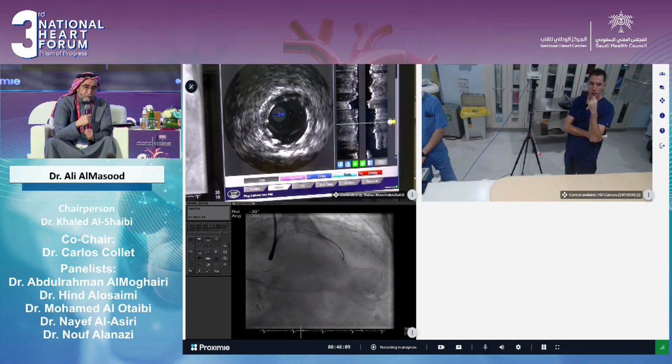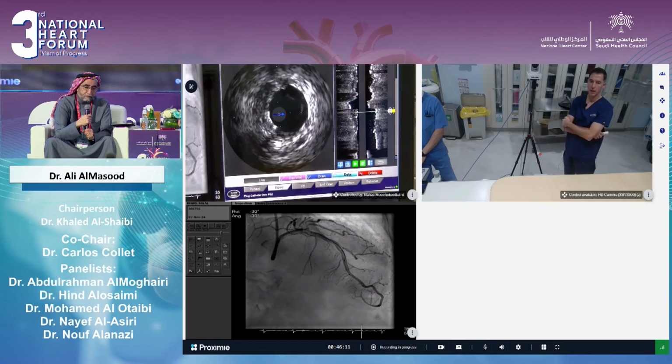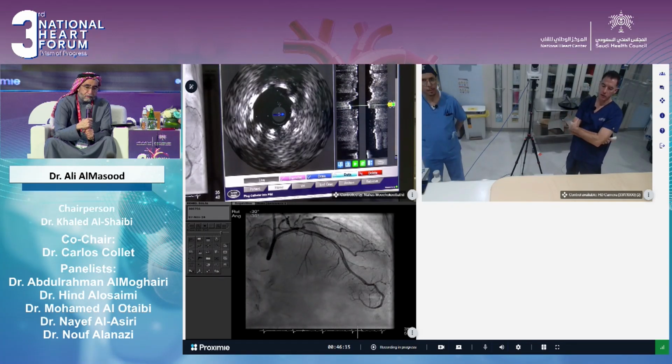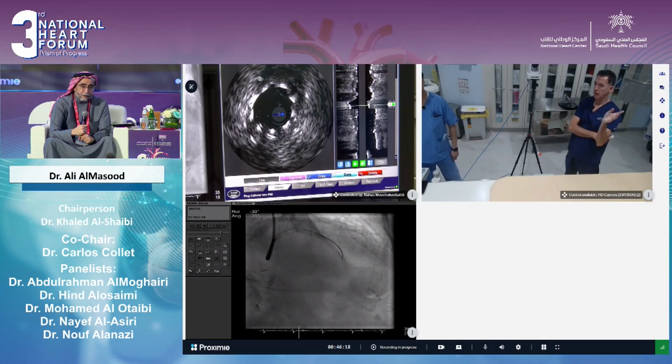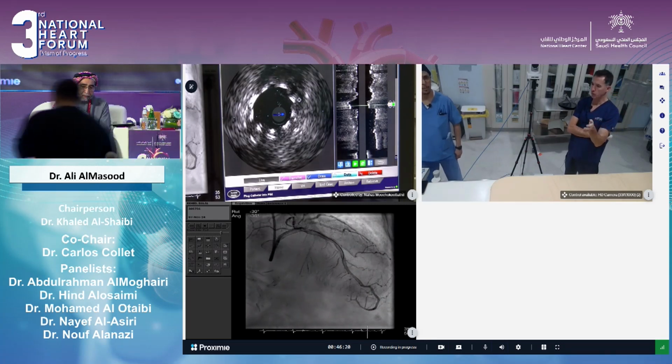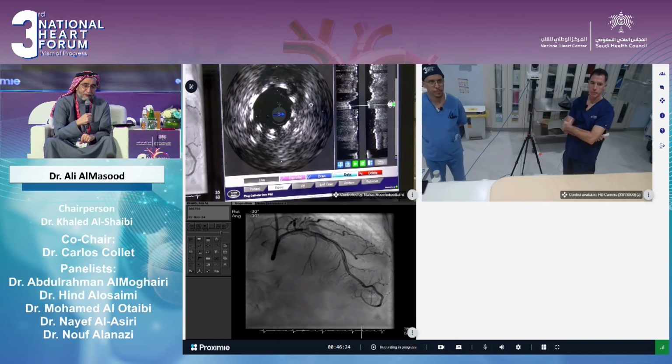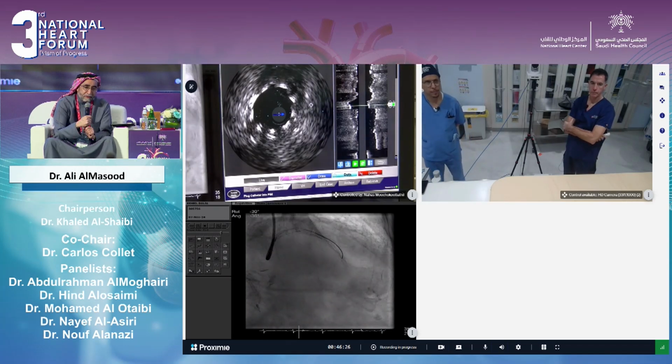There's good flow, you know, in a 75-year-old lady. We were pleased because we did talk at the start about putting a stent in that and then jailing across it in case we had trouble getting back into it, but we didn't need to. Great, thank you very much for an elegant demonstration.